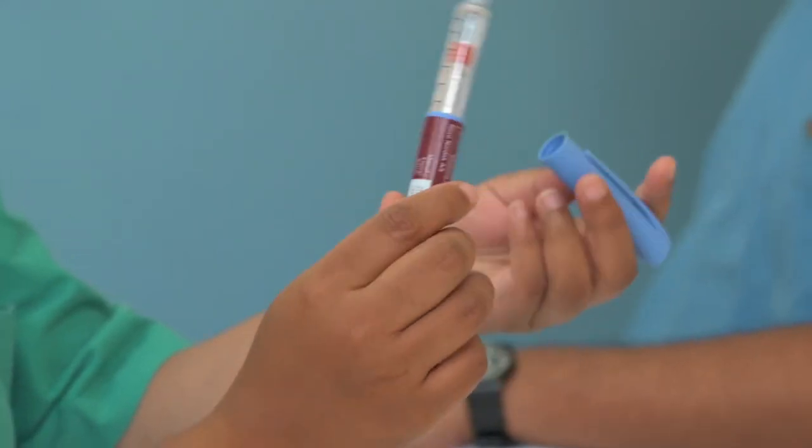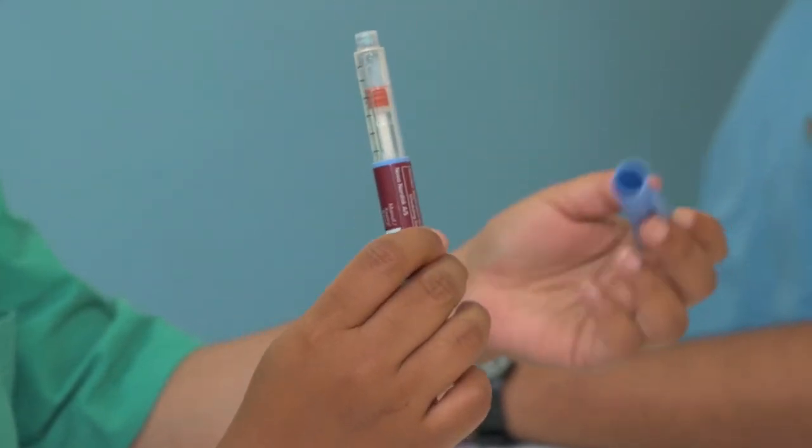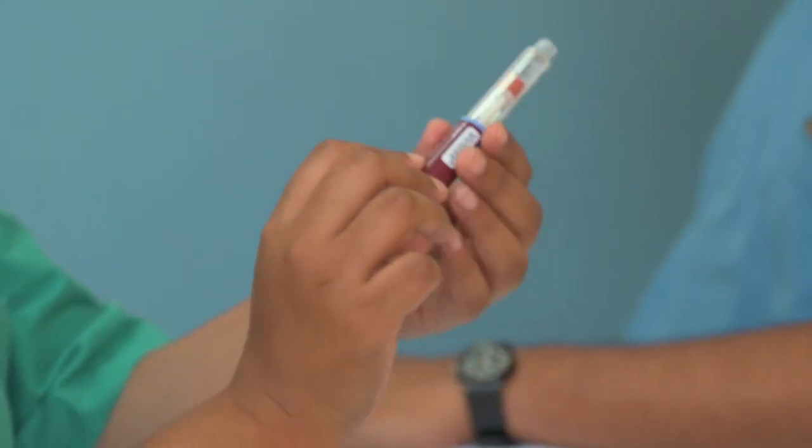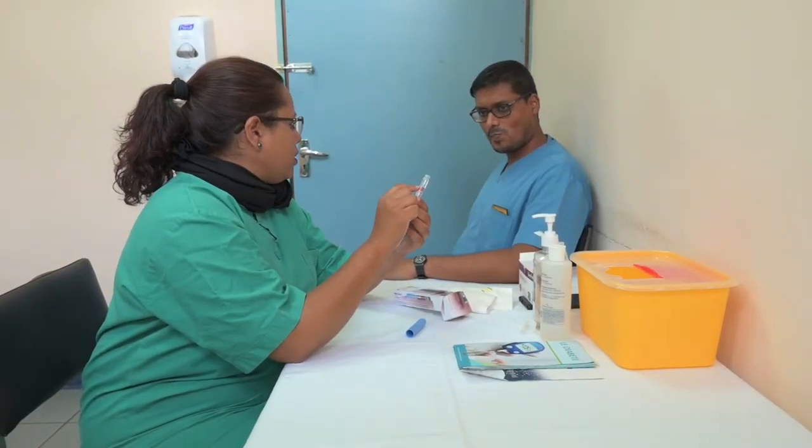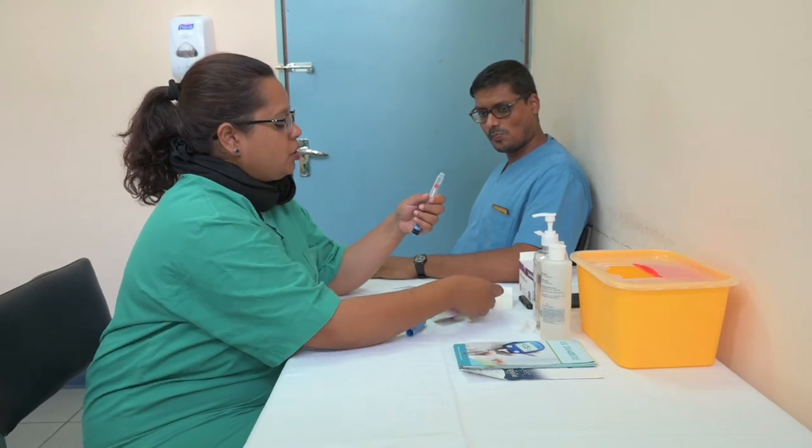First, you have to remove the big cap. You have to see the insulin. It's not clouded or anything. It's clean. Okay. Then start the procedure.